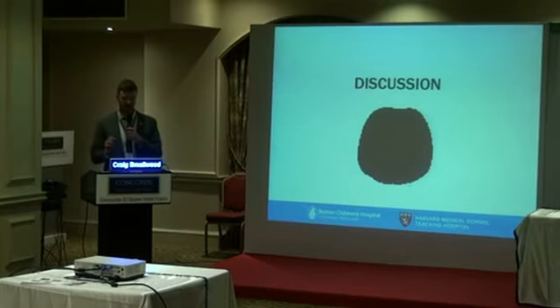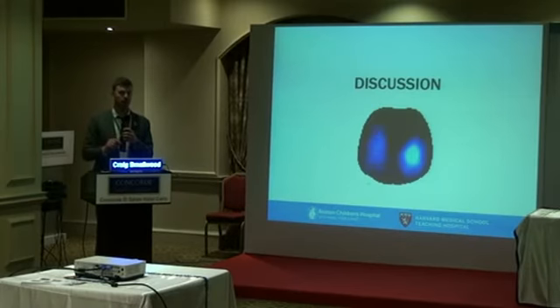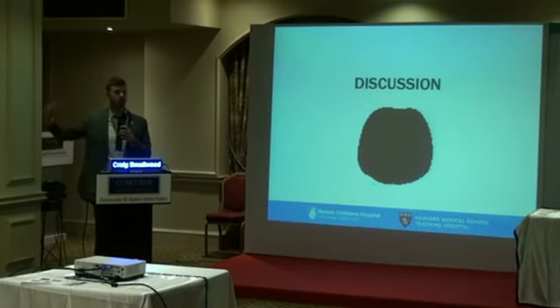I will say that the one thing that needs to be shown in the literature is really long-term use. Our use is limited to however long the protocol lasts, so maybe it's one day. I basically sit at the bedside for probably 12, 13, 14 hours straight and monitor for that period. It works extremely well, and we have had no adverse risks thus far. We also image once per day. But in terms of using the device 24 hours a day for 7, 10, 14, or 30-plus days of stay, I haven't seen that data in the literature, just because we haven't done it. But that's really the dream, right?